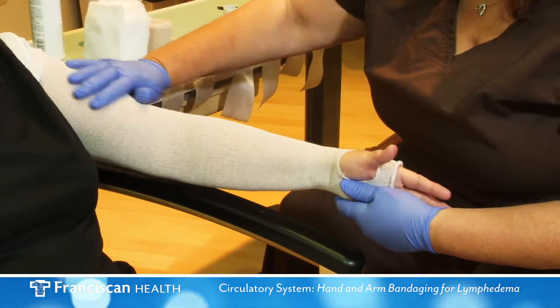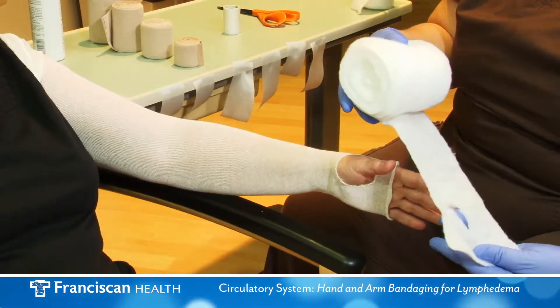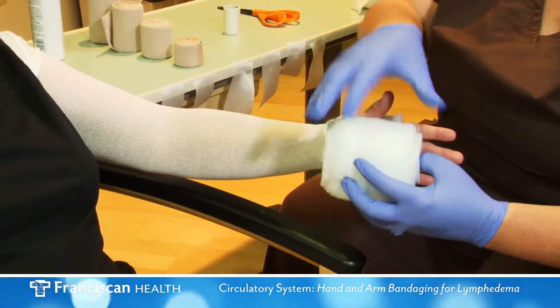Apply padding at the hand. Cut or tear a hole to accommodate the thumb, and spiral wrap padding with a 50% overlap around the hand and wrist, and proceed up the arm.